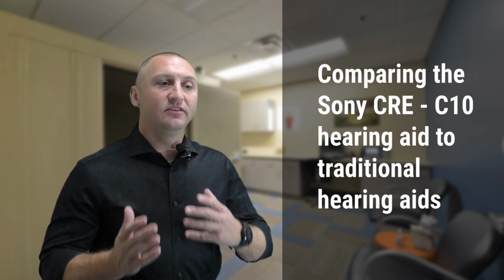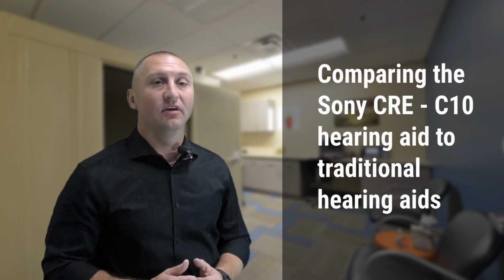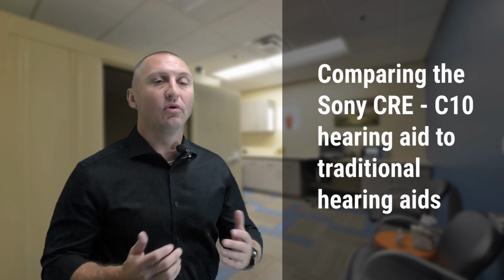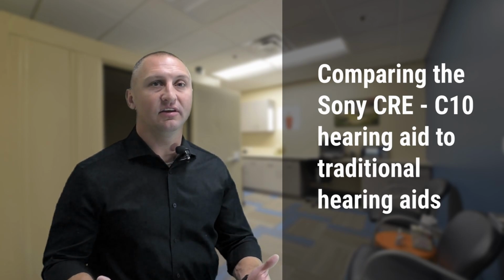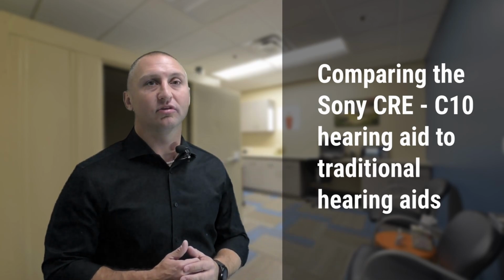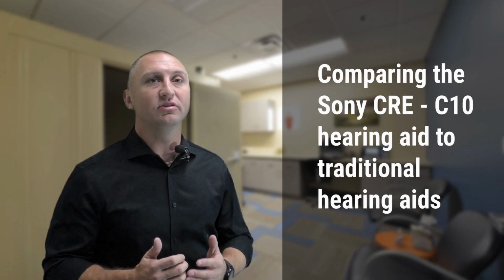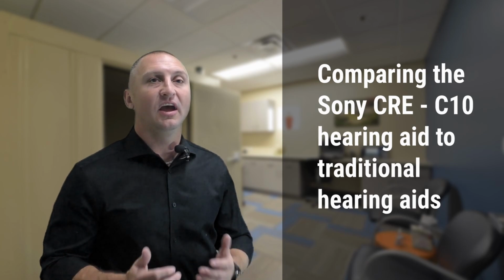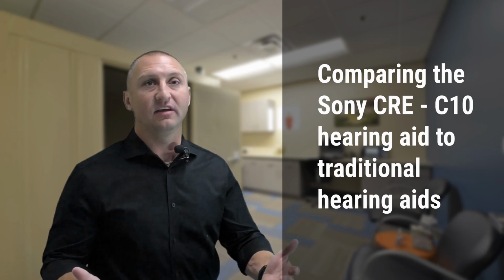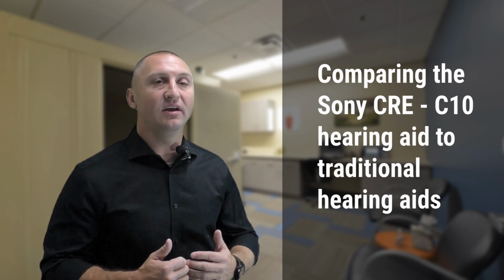Now, these hearing devices, these self-fit devices, do not require a hearing test. For the purposes of our comparison, we worked with a patient who allowed us to test their hearing, help them get this device set up, and then was also fit with a set of prescription hearing aids, so we could do a head-to-head comparison. Our real ear measures are actually going to look at the patient's real hearing loss and see how this device set where they like it compares to a set of prescription hearing aids programmed the way we as the audiologist want it set. Let's take a look and see what happens.